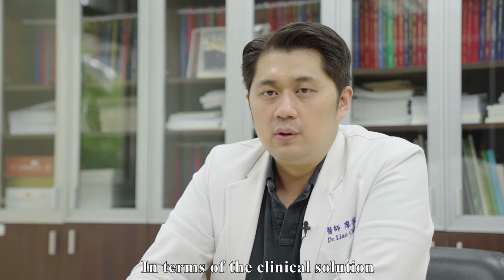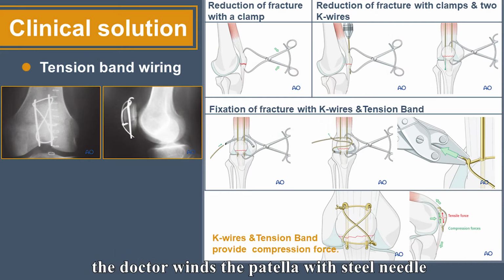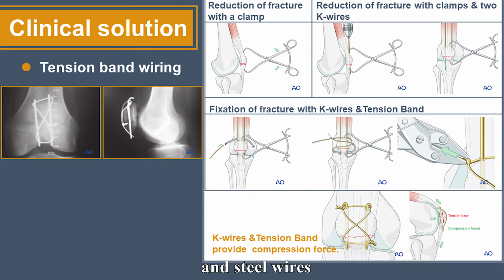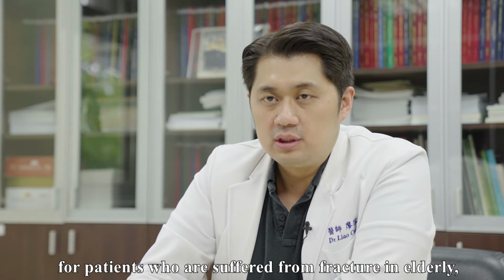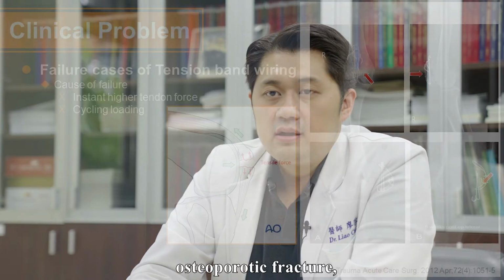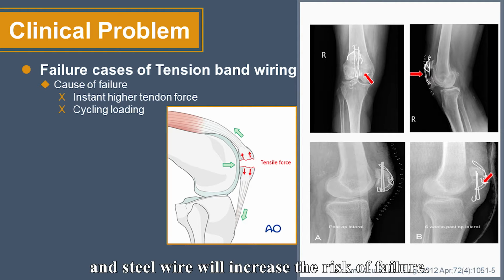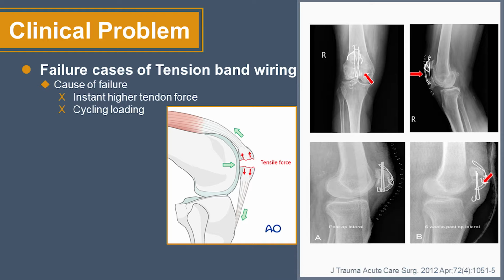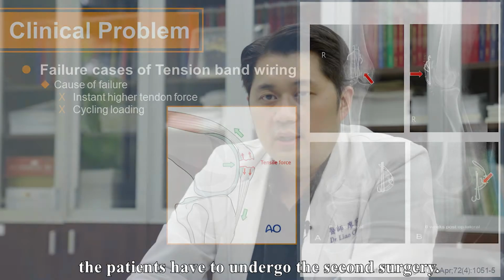In terms of the clinical solution in Taiwan nowadays, the doctor winds the patella with steel needle and steel wire so as to perform the fracture reduction. However, for patients who suffer from fracture in elderly, osteoporotic fracture, or comminuted fracture, winding the patella with steel needle and steel wire will increase the risk of failure. What's worse, the patient has to undergo a second surgery.